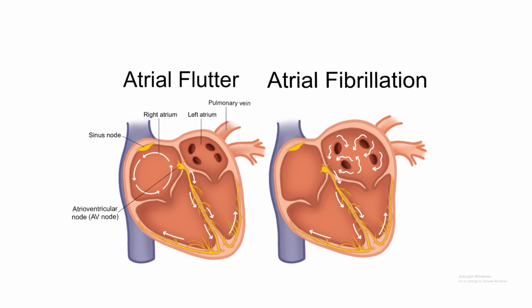But you can also have atypical A flutter, which is an irregular A flutter, because typical A flutter is normally regular, but atypical A flutter is where you can have an alternating 3-to-1 conduction and an alternating 4-to-1 conduction, depending on how many flutter waves you have before you get a normal QRS.